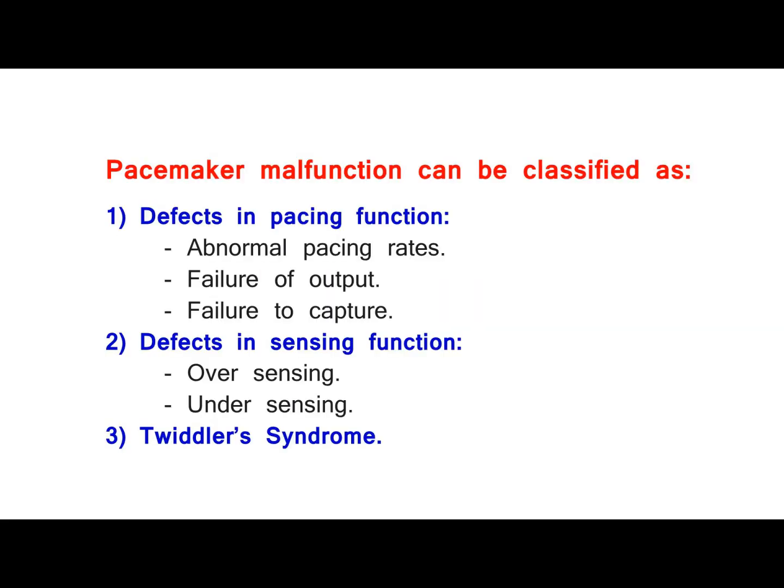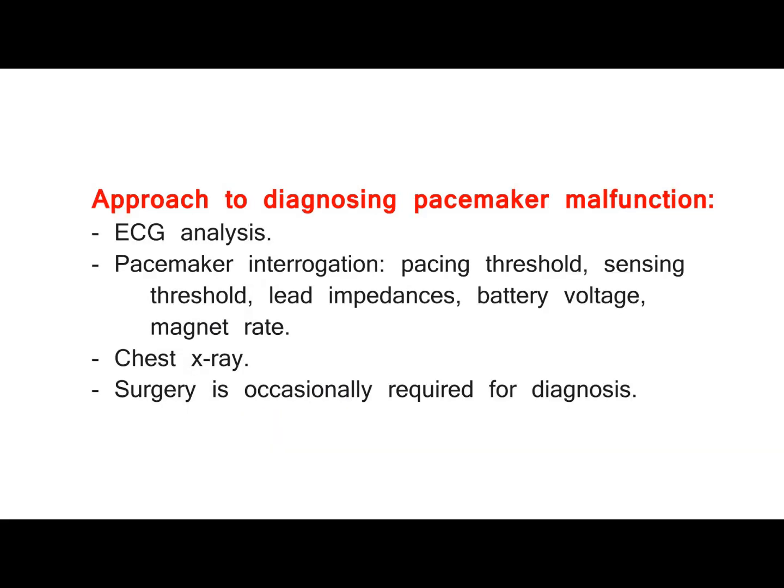Pacemaker malfunction. Pacemaker malfunction can be classified as: 1. Defects in pacing function, including abnormal pacing rates, failure of output, and failure to capture. 2. Defects in sensing function, including oversensing and undersensing. 3. Twiddler's syndrome.